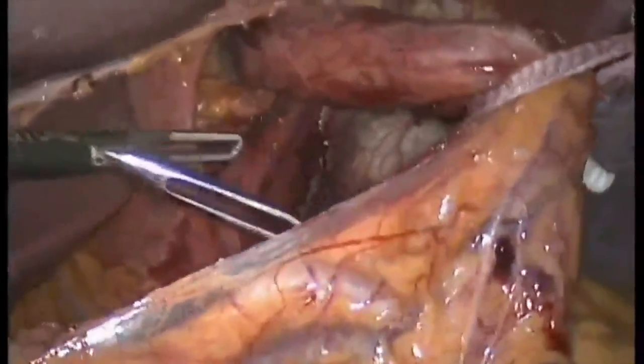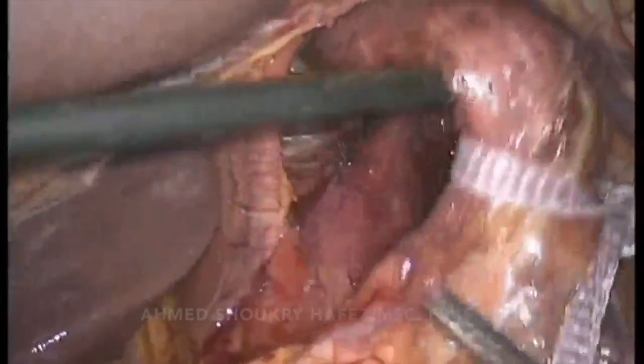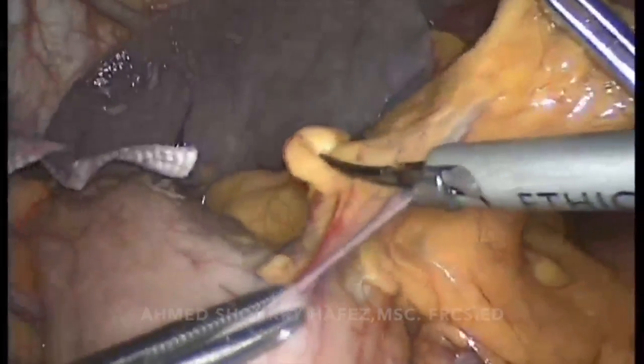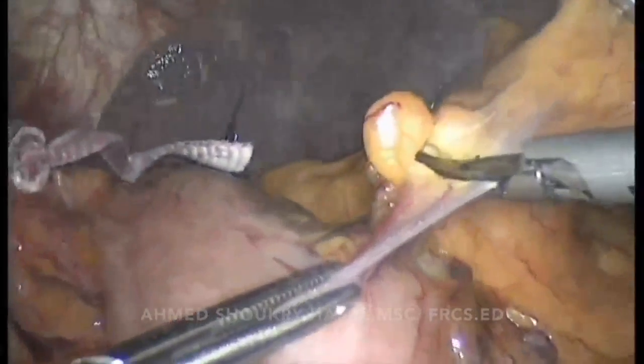Now you can appreciate the extra length added to the intra-abdominal esophagus, which is left without traction, and we have like 4 or 5 centimeters, very nicely, of intra-abdominal esophagus, which is not going back into the chest. So now we can proceed to take down the short gastrics and form the wrap.